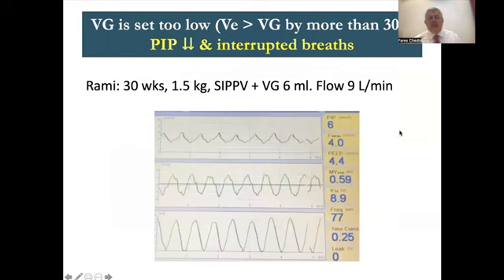Here is before my conclusion. No, I have probably 2 more slides. So this is an interesting case I had one day, and initially I didn't understand it well. That was years ago. I was near a patient and the resident came to me in the morning. He said, doctor, this patient who's on volume guarantee can be extubated because you see how his PIP is very much down. His PIP is 6. Wow, PIP is near PEEP, it's 6, it's time to extubate. And his FiO2 wasn't too high.